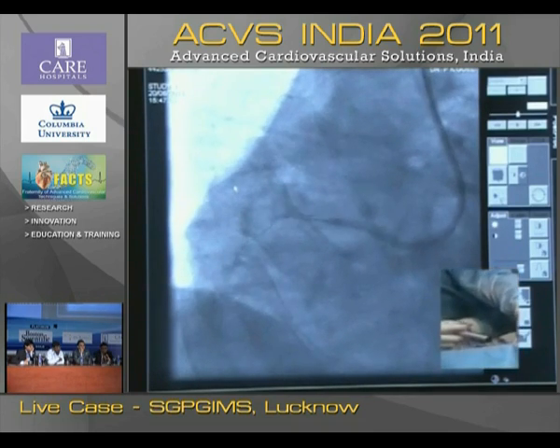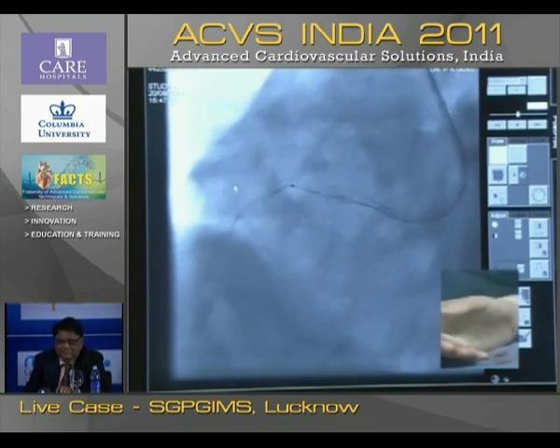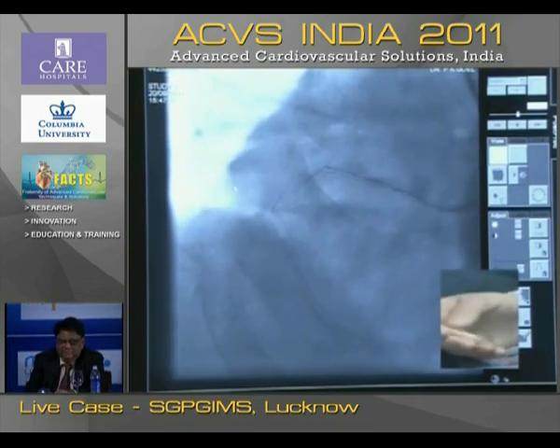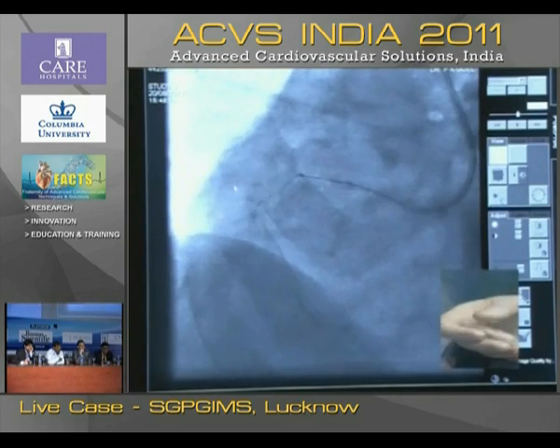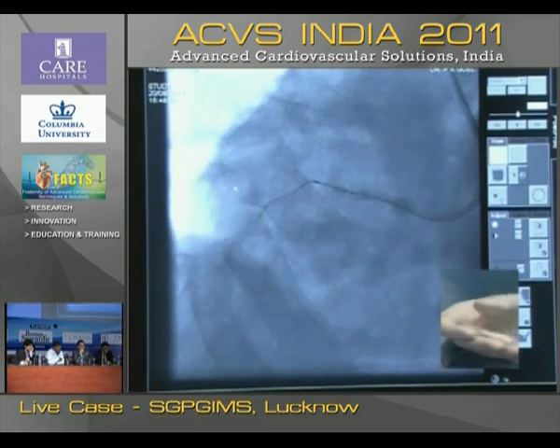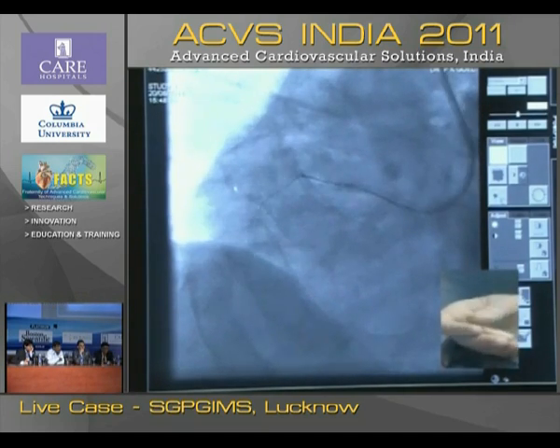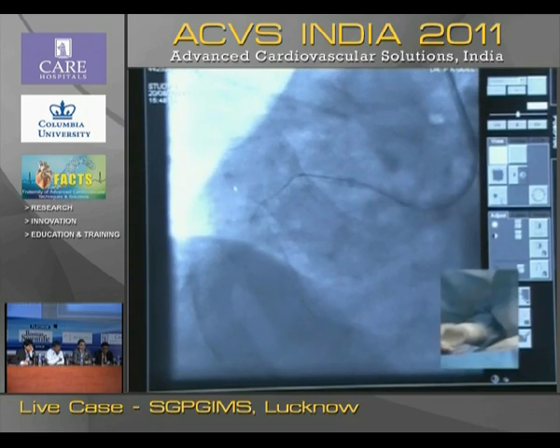Test please. Almost through the micro channel. You see, the trick here is you should not be pushing it. That's the most important thing. Rotatory movement. Let it find its way.